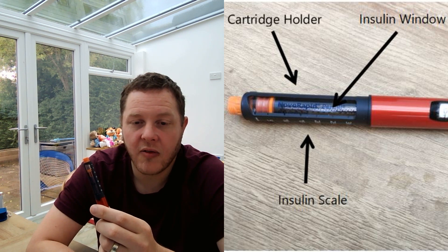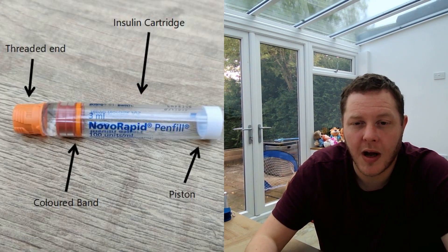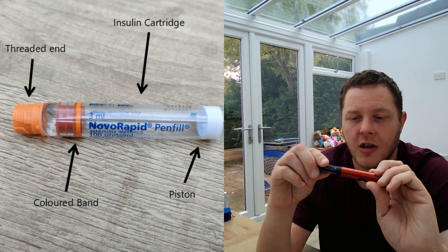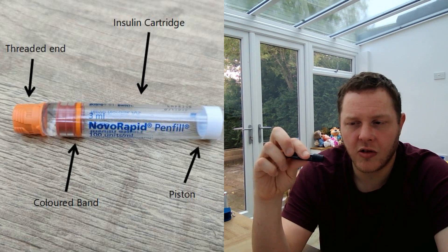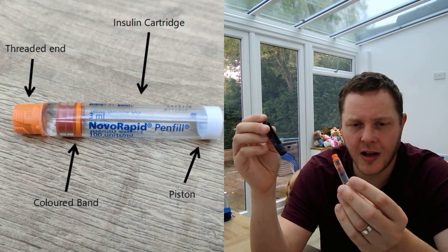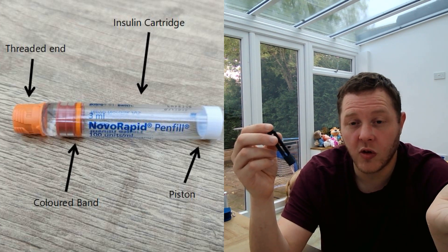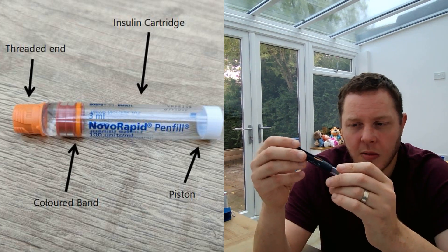You can see the insulin scale from bottom all the way up to 300, so each cartridge contains 300 units and you can see how far off you are to getting to the end of the cartridge. Let's explore a little bit more with our smart pens. You can twist the cartridge holder to take out the cartridge — simply press down and it will slide out, and you can dispose of it when you finish. When you get a new cartridge you can pop it straight back in.